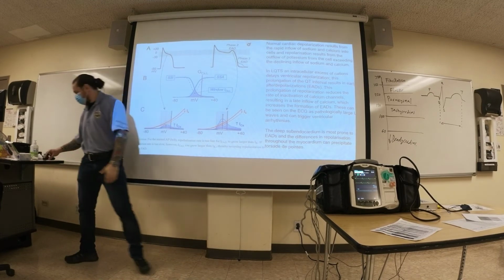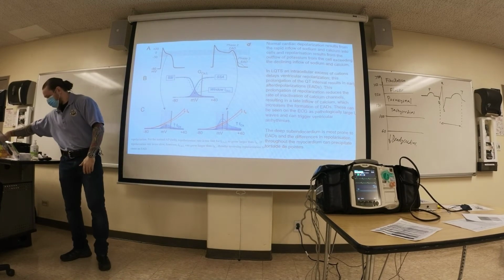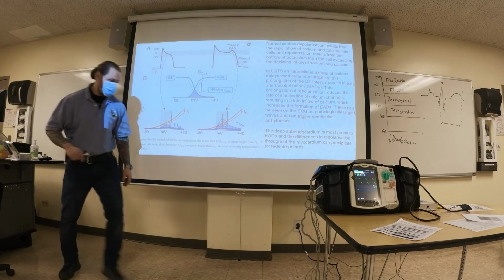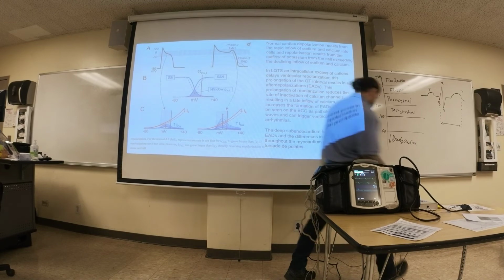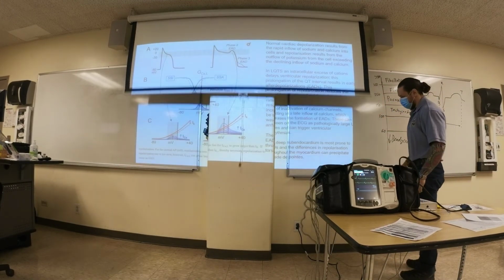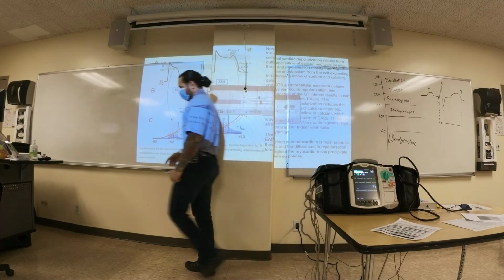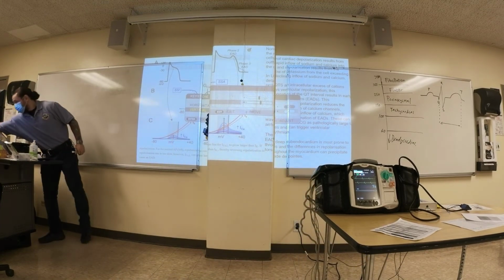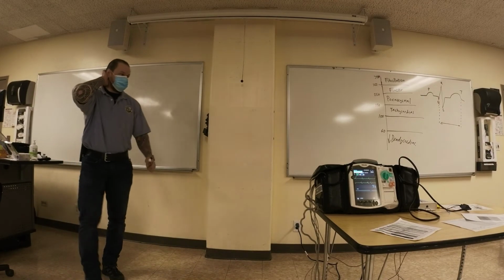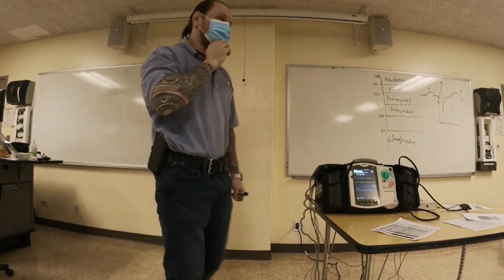So if I draw this on the side for you. Okay, so like a bundle branch block? Not necessarily.